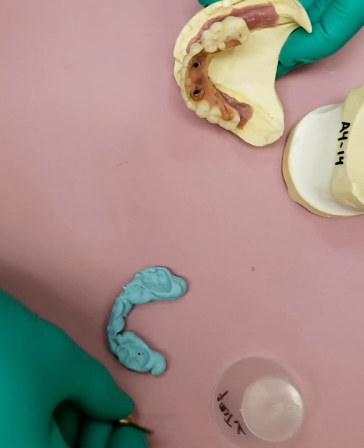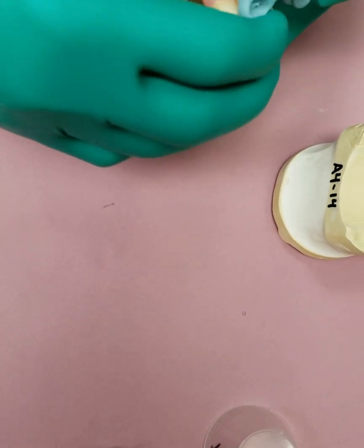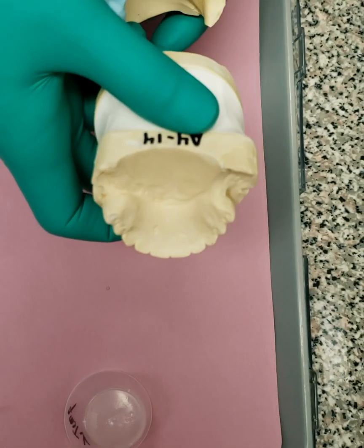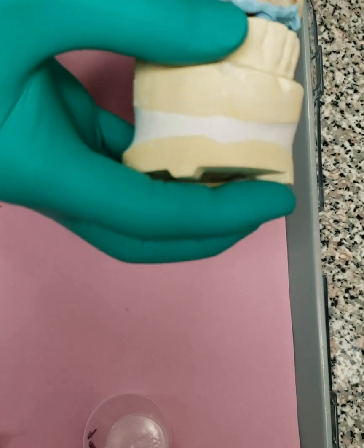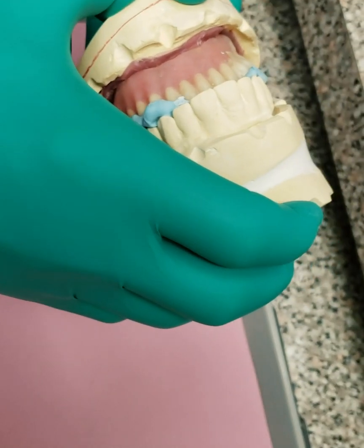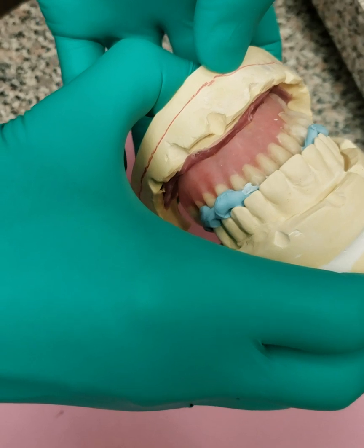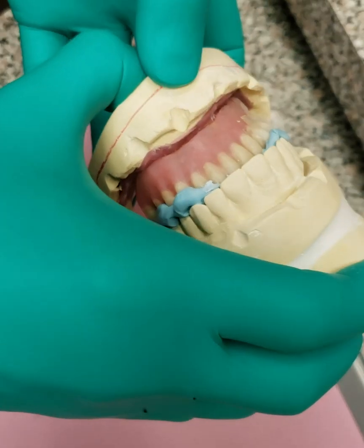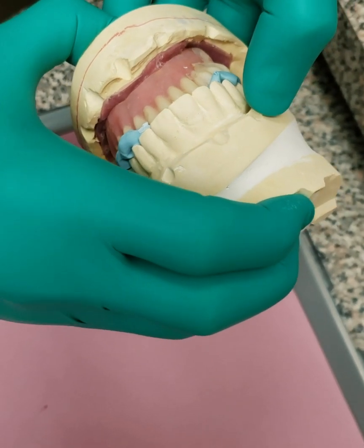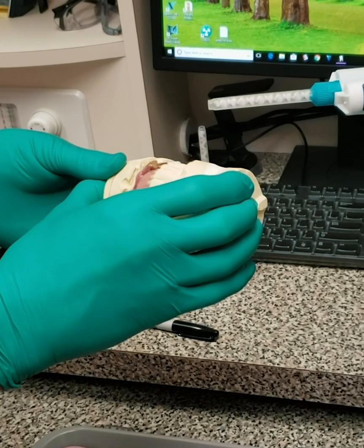Then you take one of the bites that you've taken, place it over top, make sure that everything fits down fine. Then what you do is take the upper model, and the upper model should seat exactly on that. You wind up holding this. Now, the lower has a mark of how low when we start doing the next phase it should go down, and the upper doesn't have a mark, but you always add things past where the little marks are. There's a firm hold on this, and the doctor should hold this so it doesn't move.